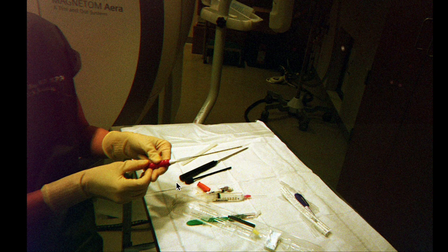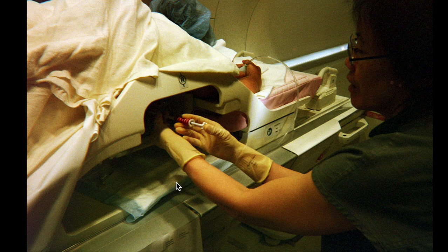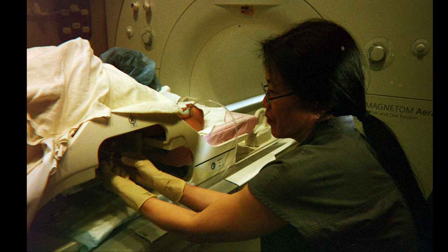Here's me getting the clip ready to put in. I put the clip in, and after I put the clip in, then I take the blue holding spacer, let's see, what would you call that? Something that holds the space when nothing's in there. I put that there, and then we take another image, and if that image looks good, then we're done, and I send the patient off for a post-biopsy mammogram.